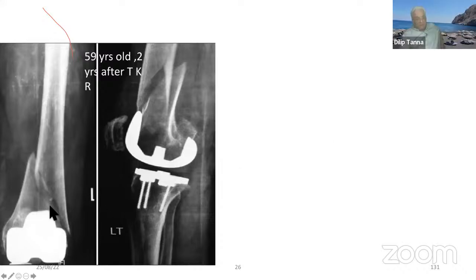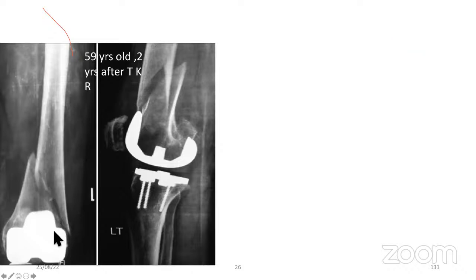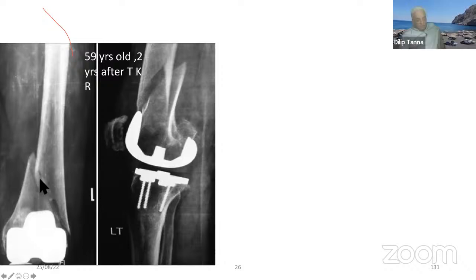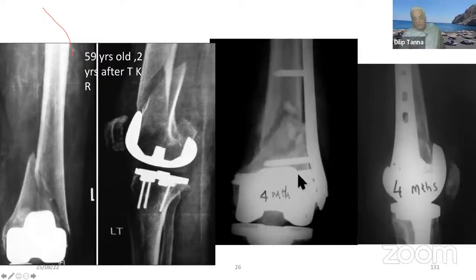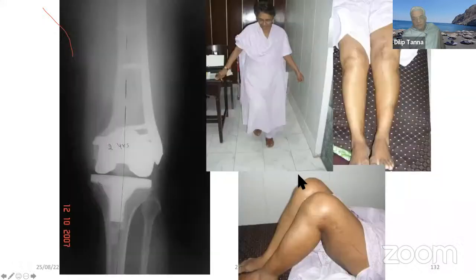Now, here is the periprosthetic fracture. Now, this fracture is a good fracture above the flare of the femur prosthesis, and this is a long, good oblique fracture. If you do this, it will heal up very well, and the patient walks about with a good axis and all.